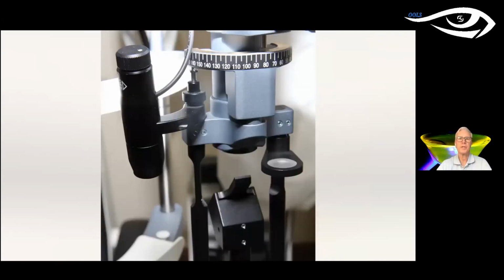Now, one thing when you take pictures of the whole adnexa, you want to get the eye and the lids and the conjunctiva, you need to diffuse the light source, right? In this slit lamp, you have a built-in diffuser, which is this little disc you see here on the right. On the middle right of the picture, you see that little kind of frosted looking glass. You swing that over the light source, over the mirror, and that diffuses the image.